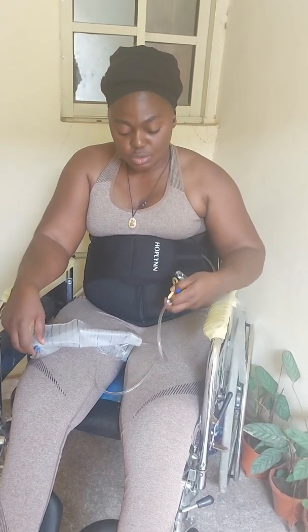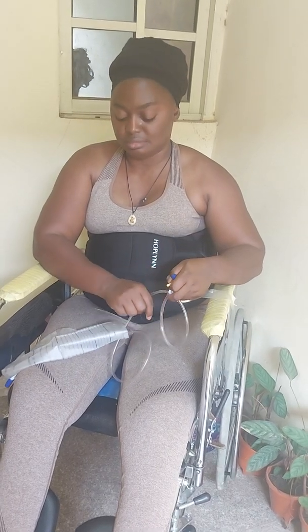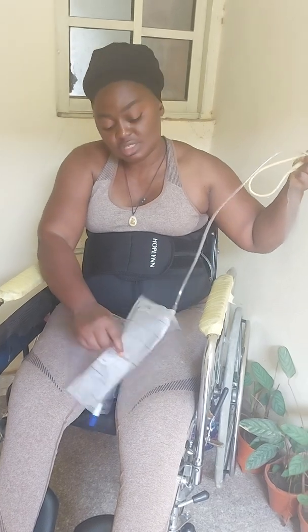So in this, to avoid having infection, to avoid falling sick, and also for people seeing it around, you can also have it tied around your leg, or customize your clothes so that it has a bag in front. So you clean it every day. You wash it when you're bathing. If you do bed bathing or shower bath, anyone, you wash it.